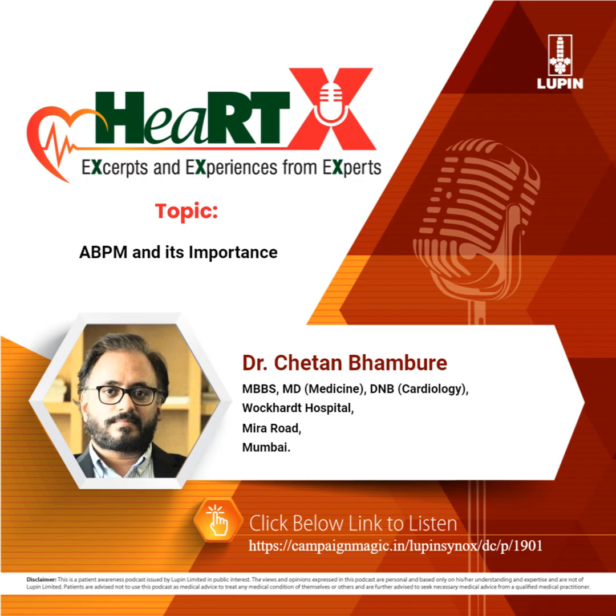ABPM has become an indispensable tool in the diagnosis and management of hypertension and its therapy. Recent guidelines from the European Society of Cardiology recommend that diagnosis of hypertension should be based on repeated office BP measurements or ABPM if feasible.